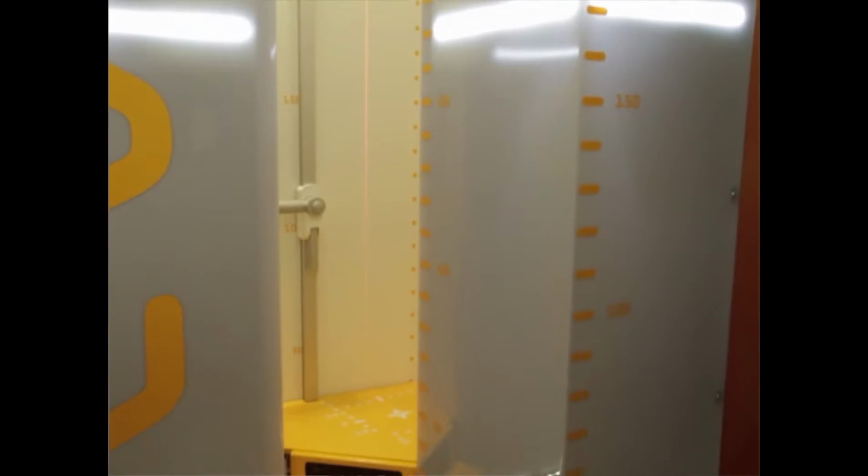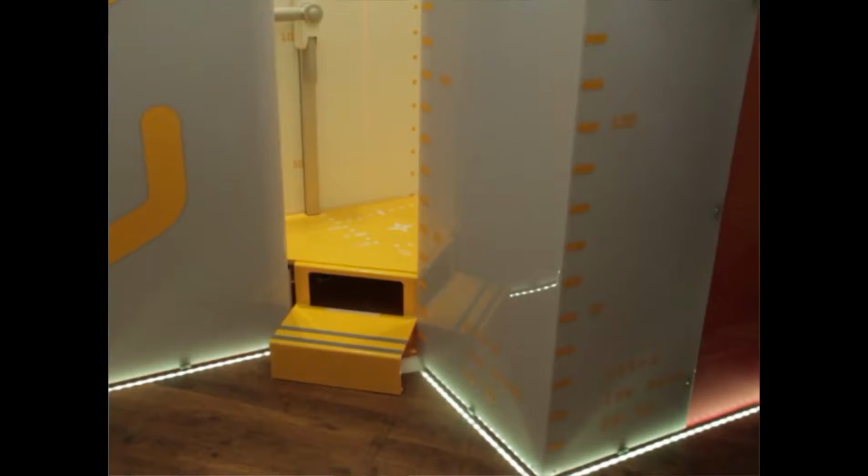When the patient is confronted with the EOS scanner, they see a very friendly environment. They don't have to strip off necessarily. They can stand in their ordinary clothes in what is like a small telephone booth. So the presentation to the patient is actually quite non-clinical. They're asked to stand still only for a minimum amount of time.